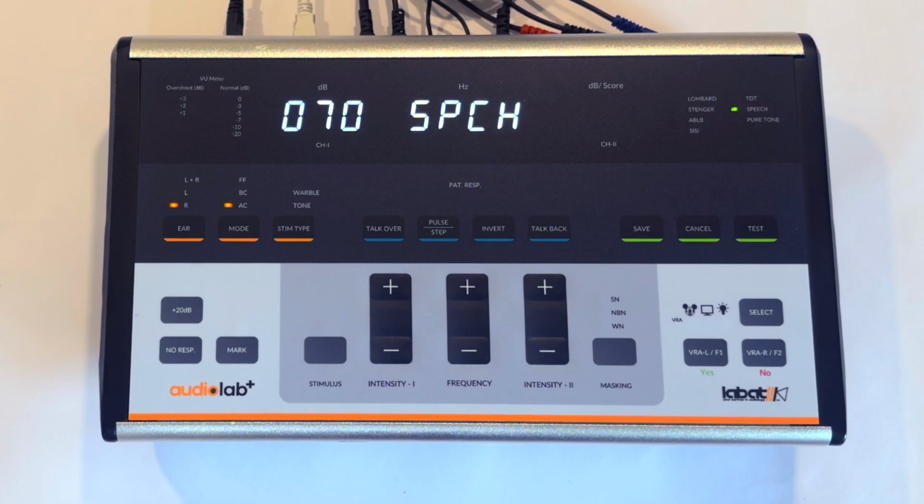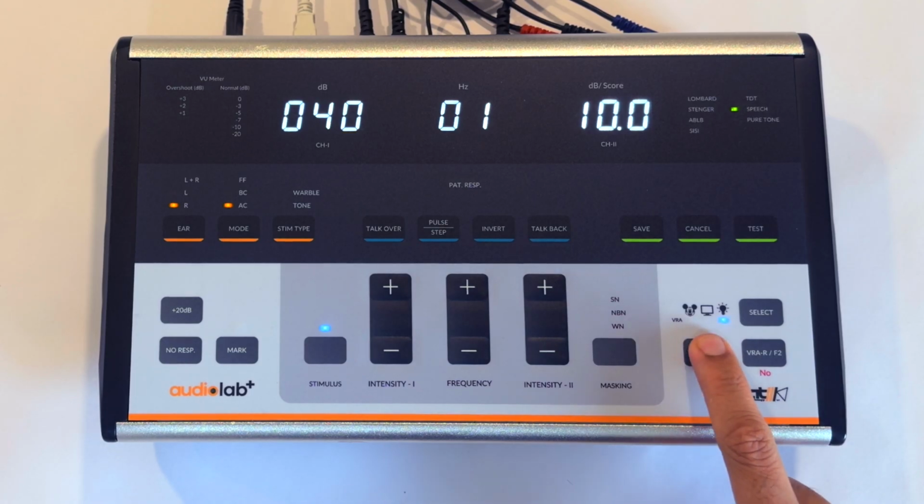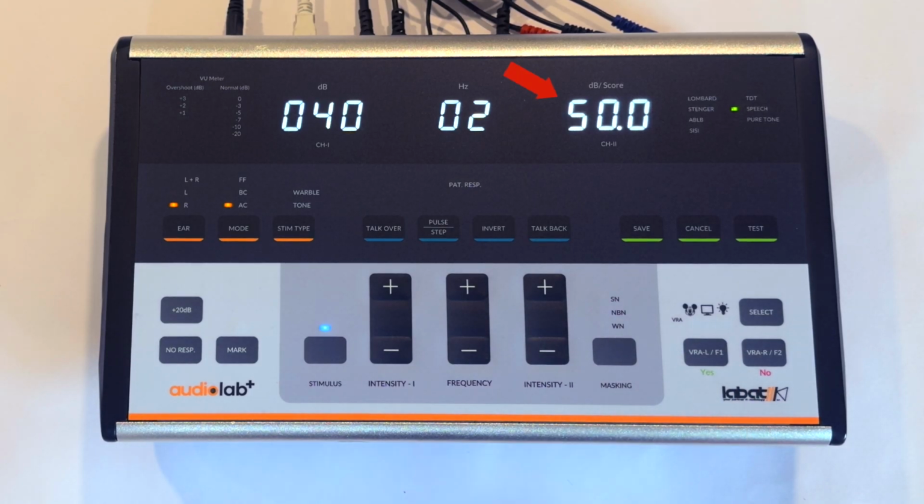Set the intensity level based on the patient's threshold. Press the stimulus key to begin. The words will be presented automatically. Record each patient response using the yes or no key. Based on these responses, record the final speech score. Press the stimulus key to stop the test.